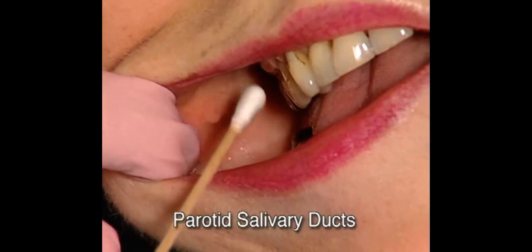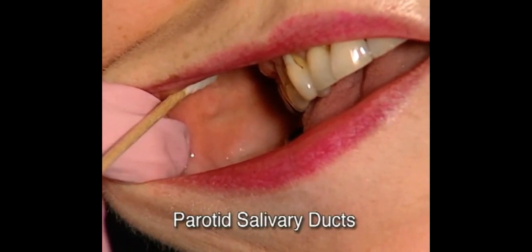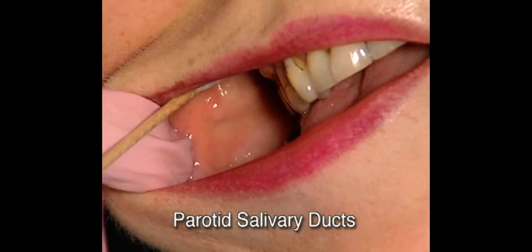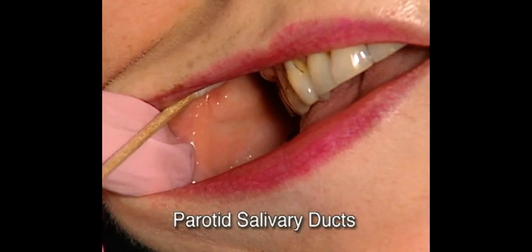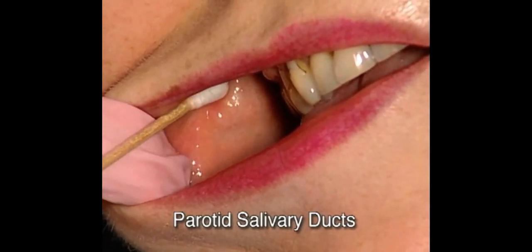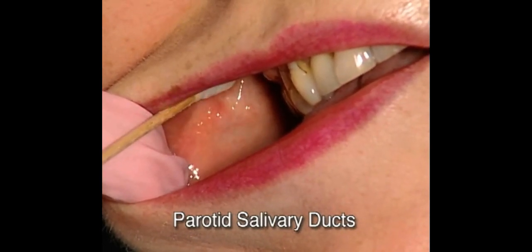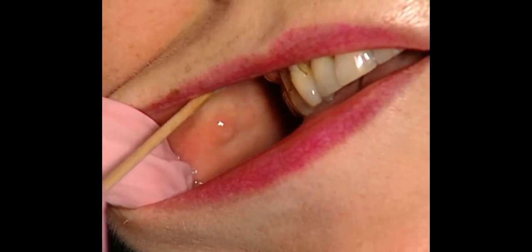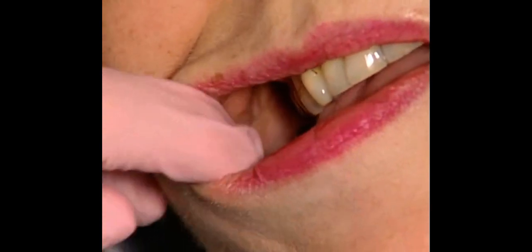Using the tip of a cotton-tipped applicator, press the area slightly above the parotid papilla. Roll the tip from an area slightly above the papilla down to the papilla while applying gentle pressure. Repeat this rolling action several times as necessary. If the duct is functioning properly, a drop of saliva will be expressed from the papilla. Evaluate the parotid gland on the left side using the same technique.